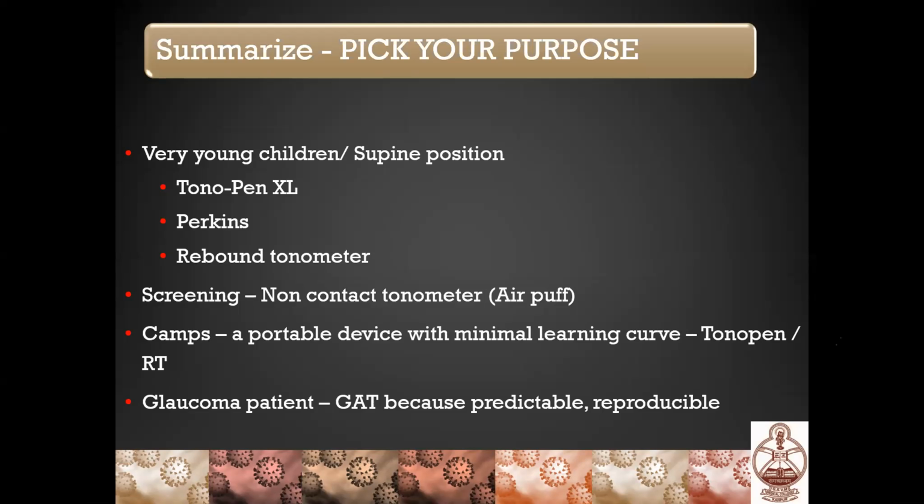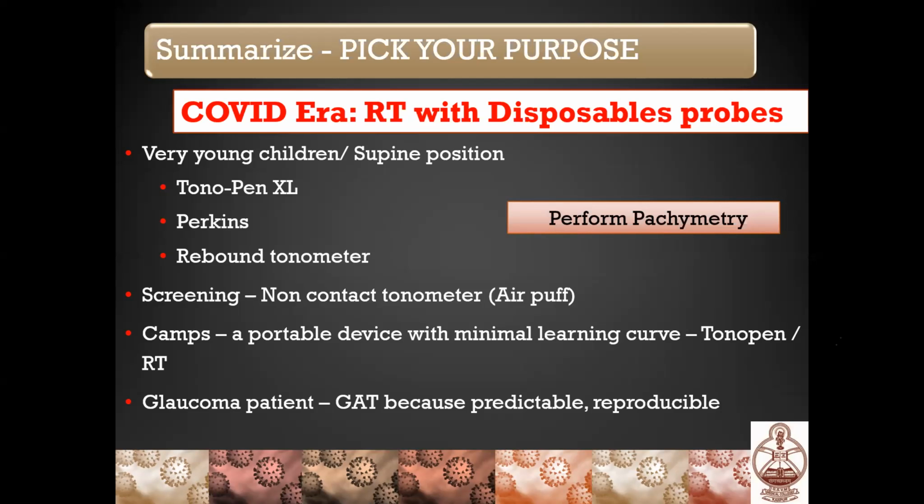But as we are discussing, it is all affected by corneal thickness, so always perform pachymetry. In the COVID era, we were talking that rebound tonometry with disposable probes is the tonometer to be used.